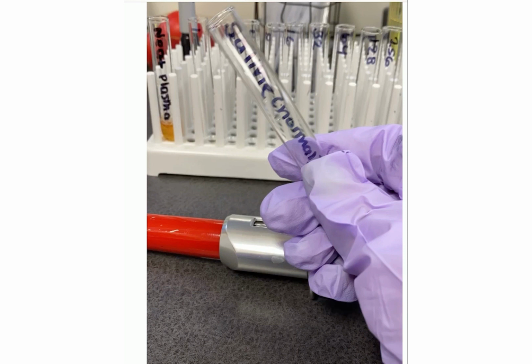I'll let you read the procedure actions in method 3-15. They're essentially left up to interpretation about how you'd like to create a master dilution. I'm going to show you a video of how I perform a titer and how I performed it at the facilities that I've worked in, but they can vary depending on where you work.